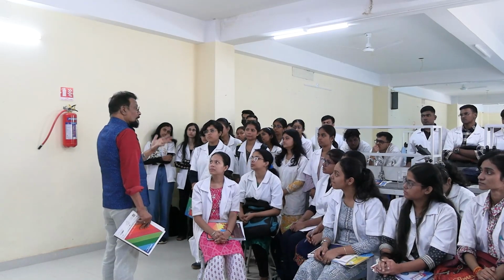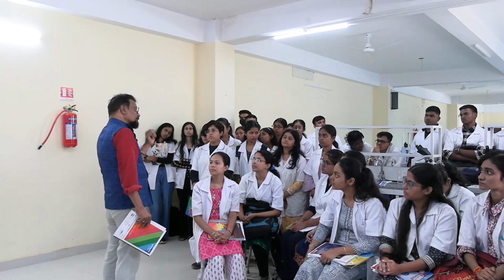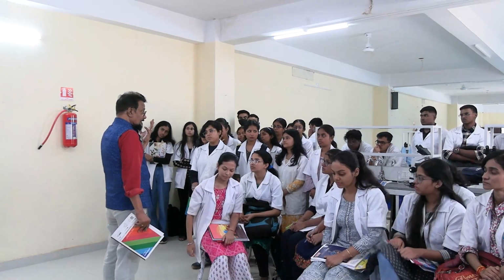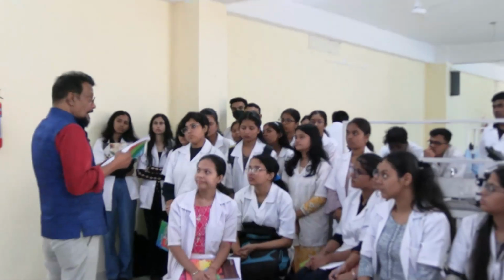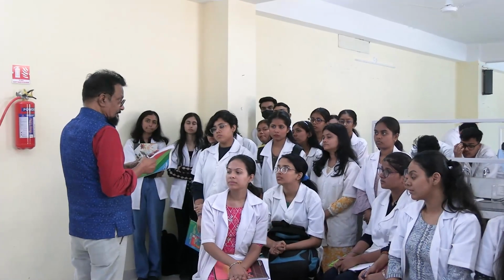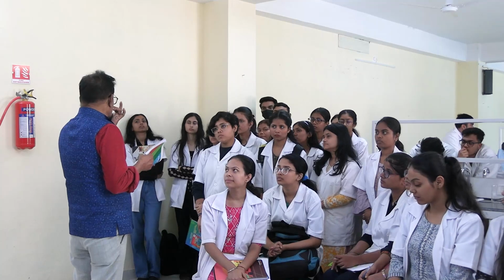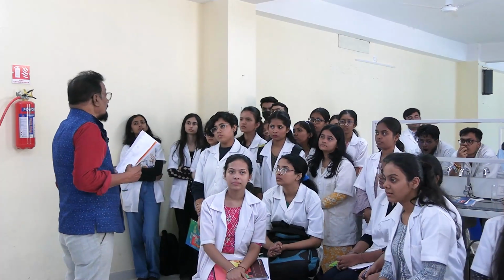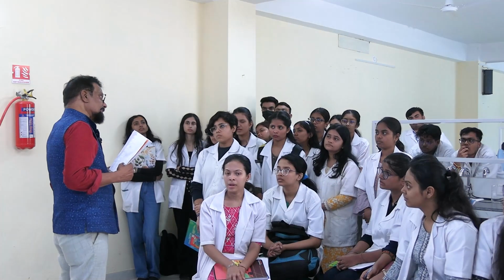Some abnormal cells you can also get there, maybe a cancer cell. So for identification of abnormal cells also, a blood smear is needed. So this is the importance of the blood smear. Now sir will tell you how to prepare the blood smear.